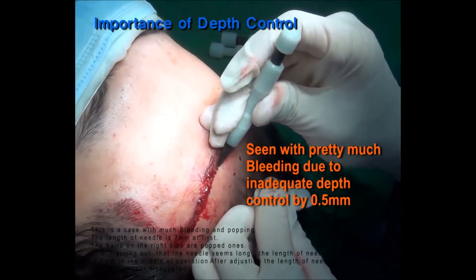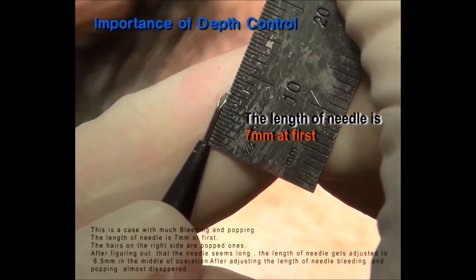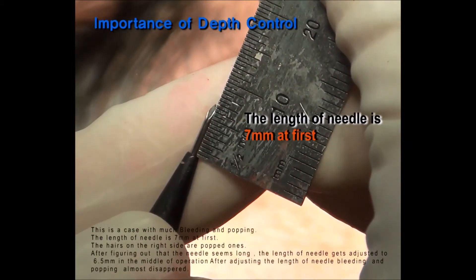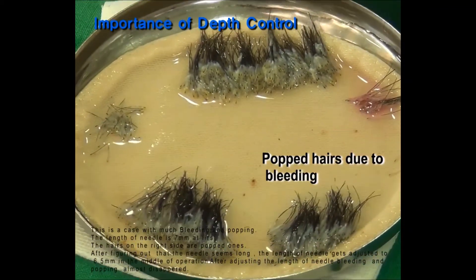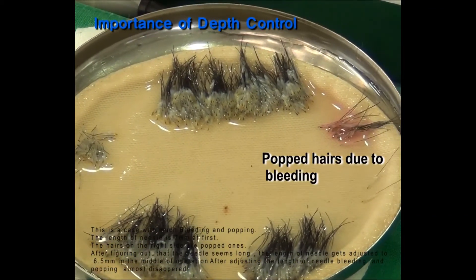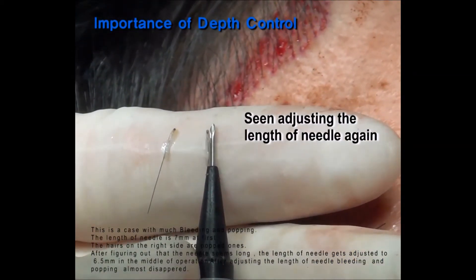This is a case with much bleeding and popping. The length of the needle is 7mm at first. The hairs on the right side are popped ones. After figuring out that the needle seems long, the length of the needle gets adjusted to 6.5mm in the middle of the operation.